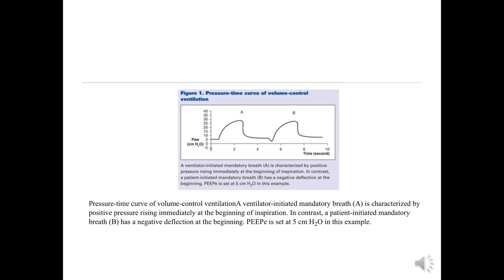In the patient-initiated breath there is a deflection — an initial dip in the pressure depicting the patient trigger — and then from that dip the pressure increases. This is the pressure-time scalar of a volume control ventilation.